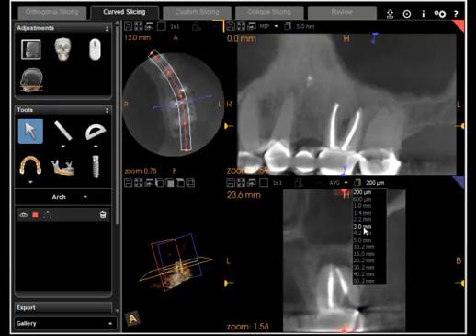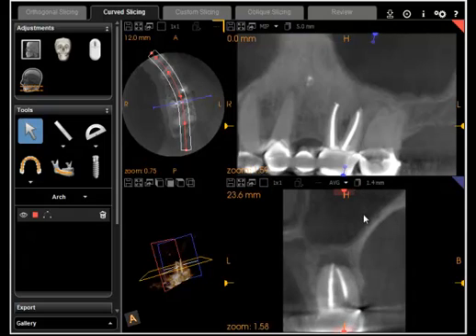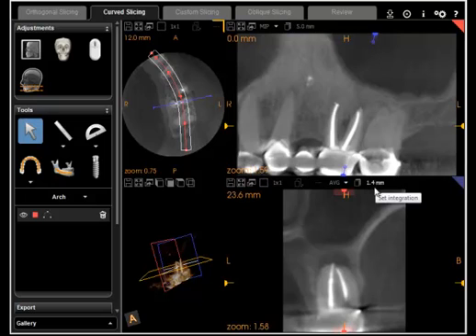You can also thicken that slice to see more of the anatomy. Here this number is 1.4 millimeters.